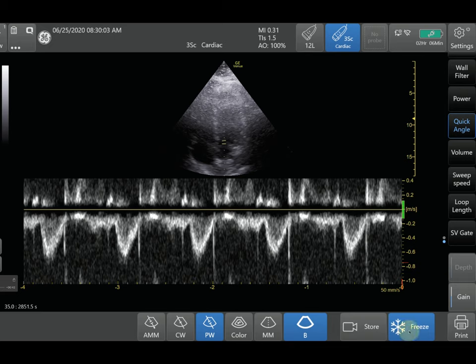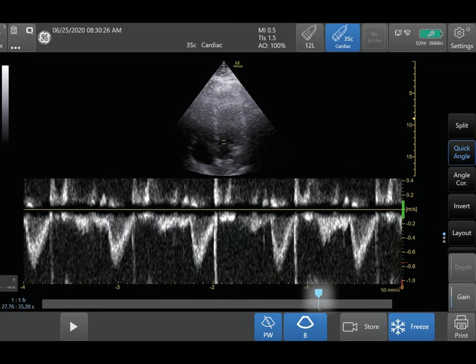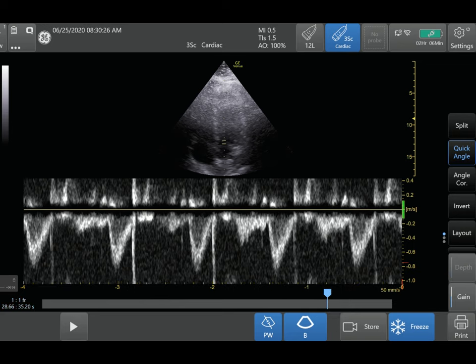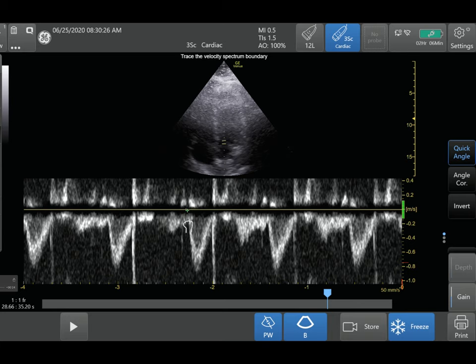Once you've optimized your gain, scale, and sweep speed, push freeze. You can then scroll to whatever tracing you want — the machine records quite a lot, up to around 35 seconds, so you can scroll back to capture a specific frame. Focus on one tracing you want, click the measure button, select LVOT tracing, go to the bottom of your LVOT tracing, and trace out that measurement.